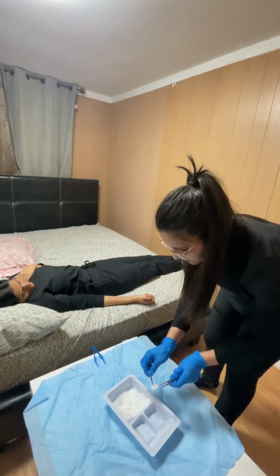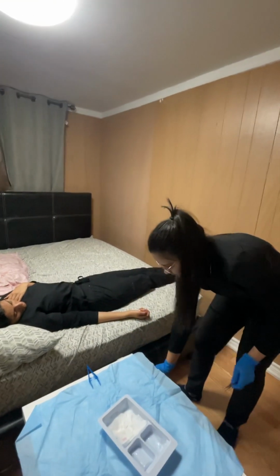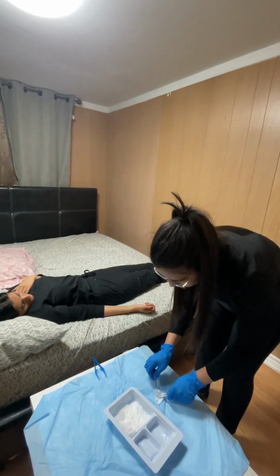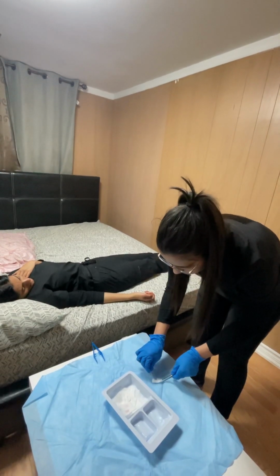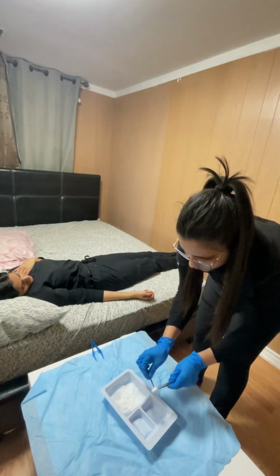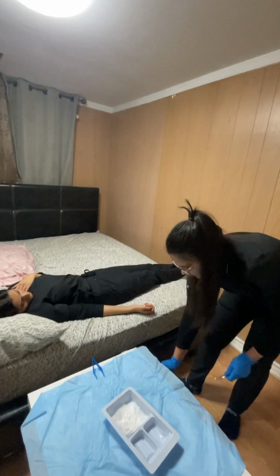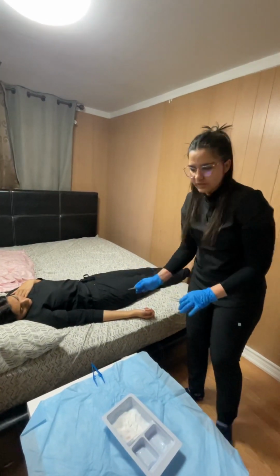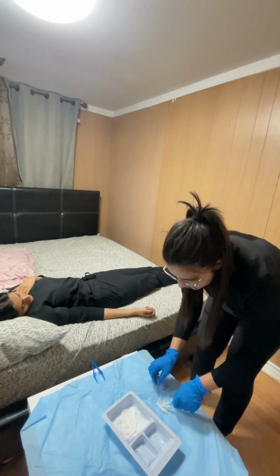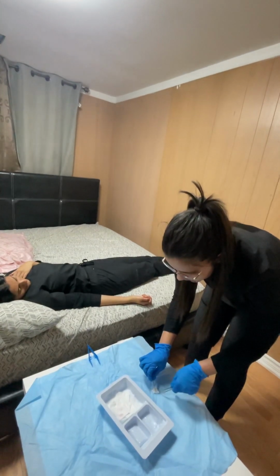Remove the excess. So the area closest to me, discarding it off, making another dumpling, soaking in solution, removing the excess, so along the midline, and discarding it off. So the wound has been cleaned. Now we'll pat it dry by making another dumpling in the same order as we have already done.